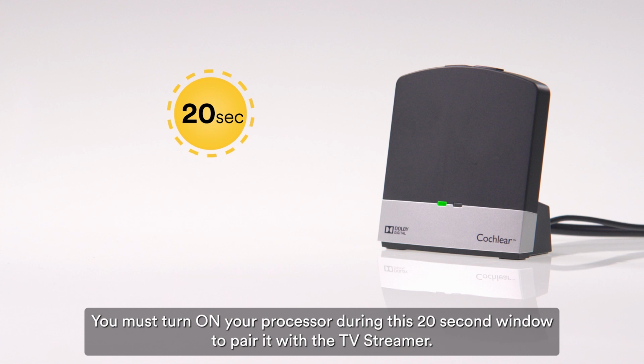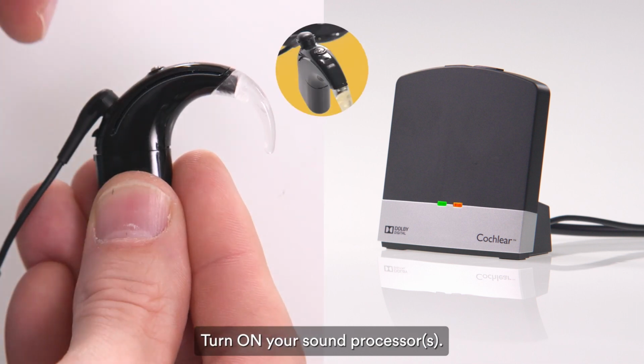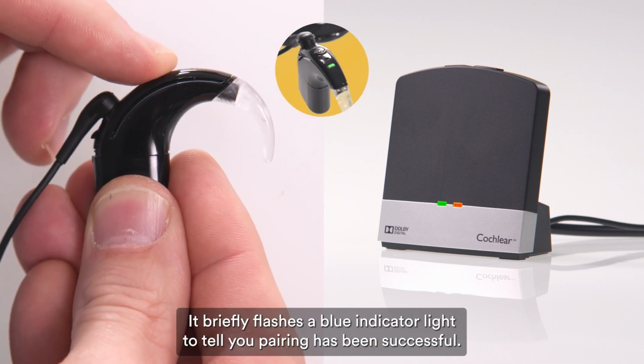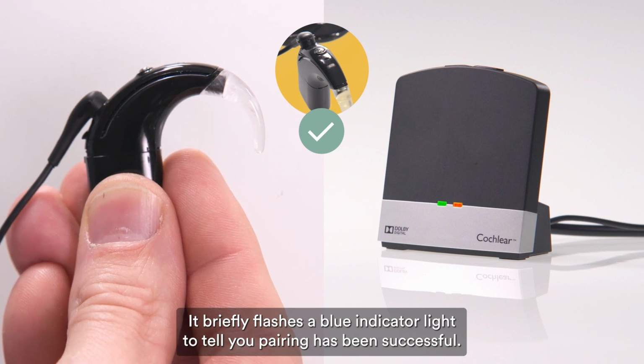You must turn on your processor during this 20-second window to pair it with the TV streamer. Turn on your sound processor. It briefly flashes a blue indicator light to tell you pairing has been successful.